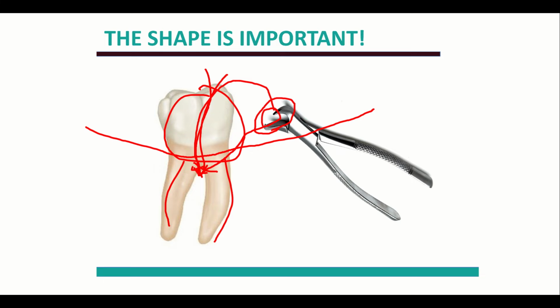And these forceps are very commonly called cow horns because when you open them up, they kind of look like cow horns. So almost every office will use that terminology. Megan, will you go get me the cow horn plier forceps, please? And those are the ones you'd go get.